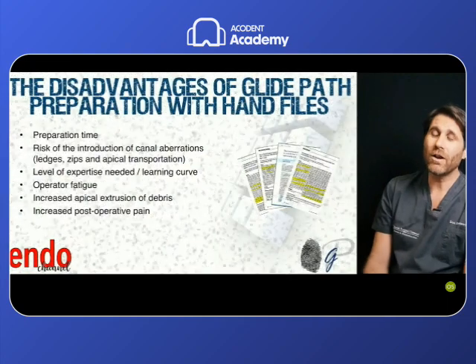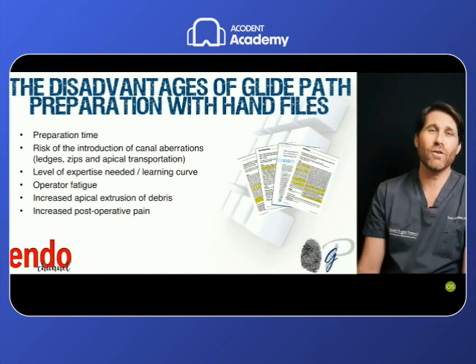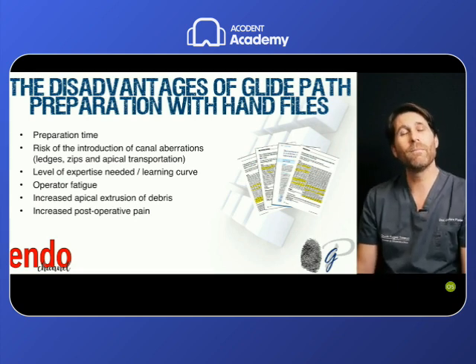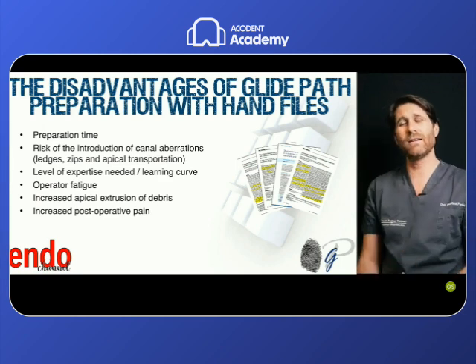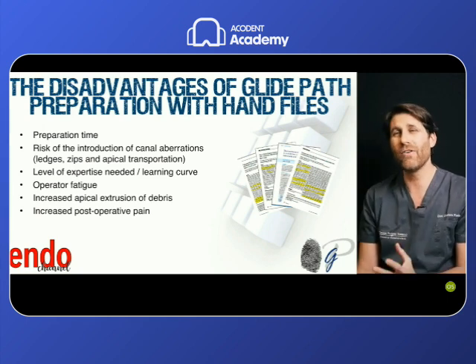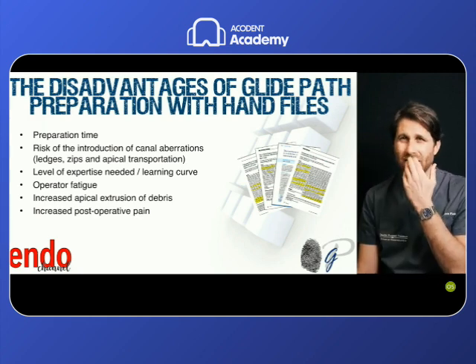But we have a lot of disadvantages of preparing the glide path like this with hand files, the same disadvantages that we have seen before for the preparation of the preflaring with hand files. We increase the preparation time. The most important disadvantage is that we increase the risk for introduction of canal aberrations like ledges, zips, and apical transportation. This is a very difficult procedure to do by hand, so we need a skilled operator, a very long learning curve, and the operator fatigue is very high. And then we increase the apical extrusion of debris and the possibility of post-operative pain with hand stainless steel files and this movement to transport the debris outside.